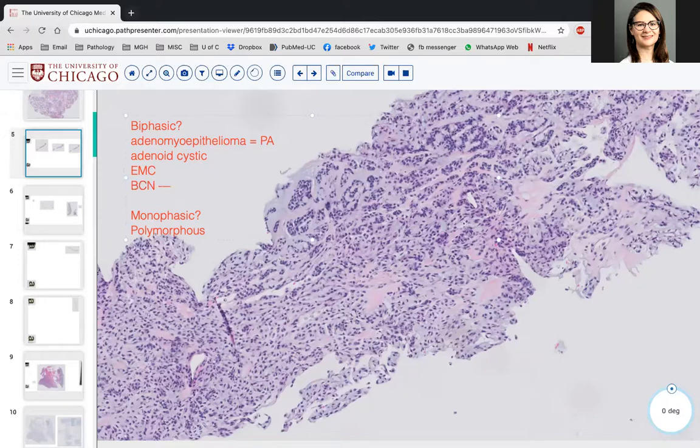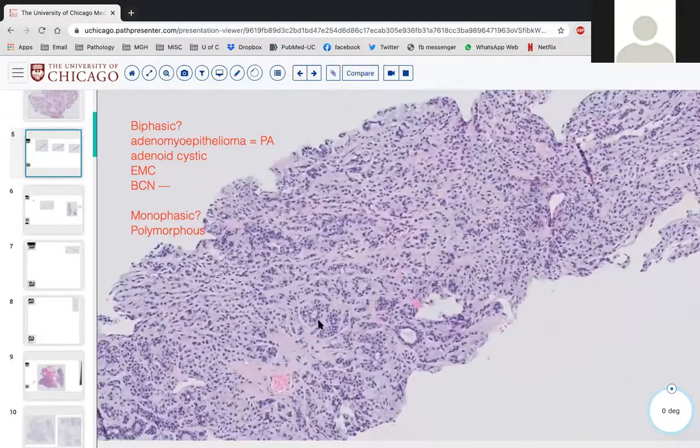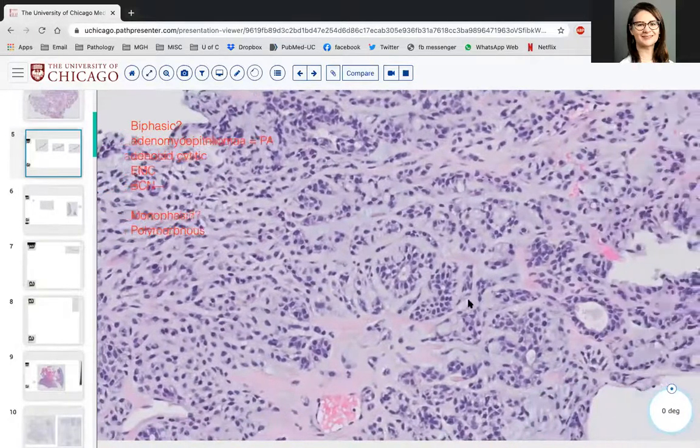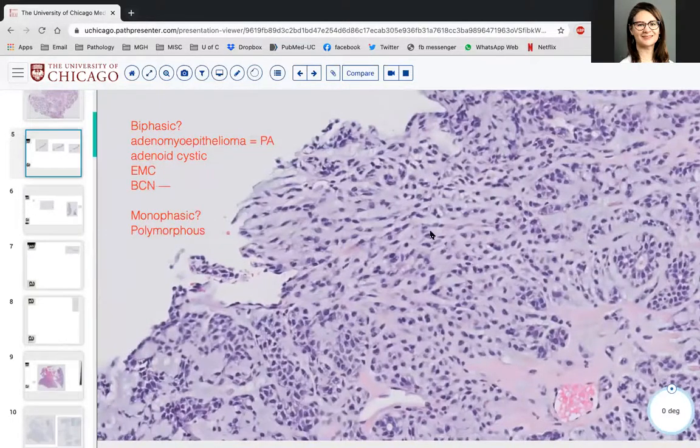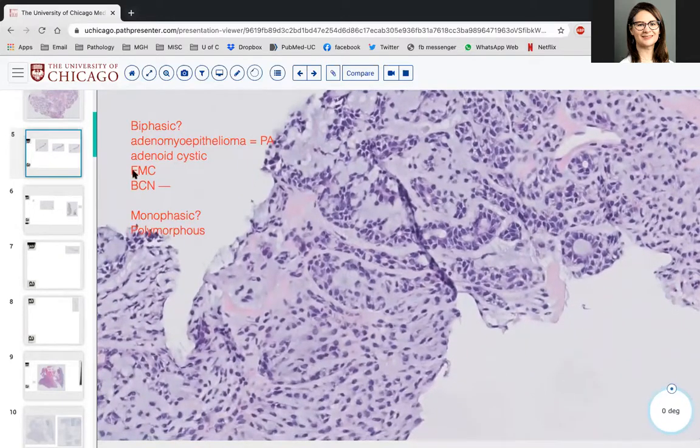What's missing here that usually is present in basal cell neoplasms, either adenomas or carcinomas? Like basement membrane material or? Yeah, so the very eosinophilic basement membrane material, as well as those kind of jigsaw puzzle architecture, right? How would you describe the architecture in this case? More trabecular, honestly. Trabecular to tubular. Yeah, so there are tubules and ducts. There are these trabecular cords of sort of individual cells streaming within this myxoid background. So I think this is a good differential diagnosis.